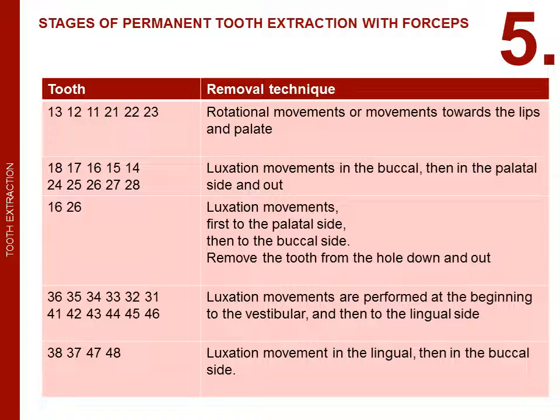Remove the tooth from the socket down and out. The palatal wall of the alveoli is thinner and the buccal wall is thickened due to the crista zygomaticoalveolaris.